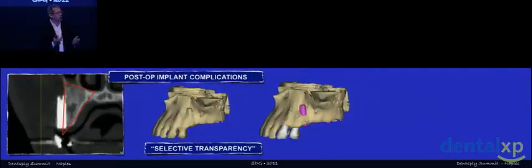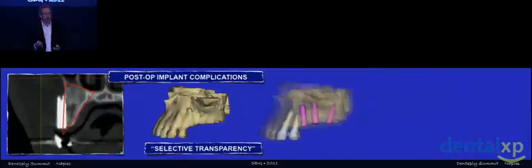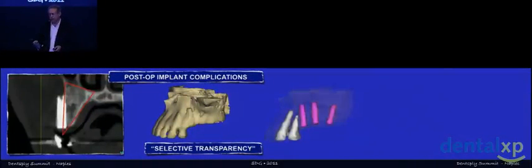Well, when you take a look at a situation like this, where an implant was supposed to be placed in a sinus elevation in an augmented site and missed the bone completely, today we're using technology to look at our mistakes and to see what kind of complications had occurred. We can use some of the wonderful segmentation properties of advanced software applications like Simplant, which allows us to segment out some of the anatomical landmarks and see that, in fact, the implant missed the bone entirely and is sticking out through the facial plate of the bone. So the augmentation procedure is a failure. The implant had to be removed.